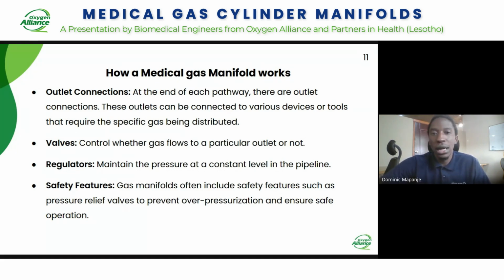And then you also have the safety features. So these are for safety. For example, you have safety valves or relief valves. These will blow off the excess pressure in your pipeline. So this is to ensure safe operation.